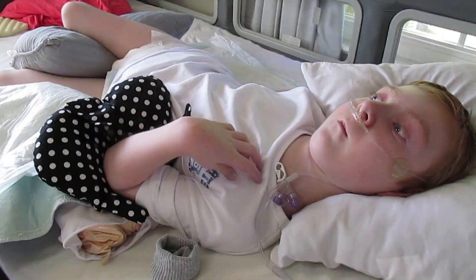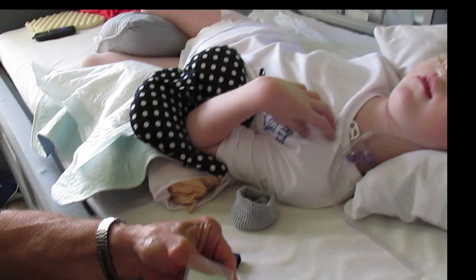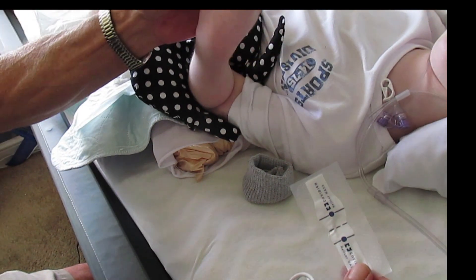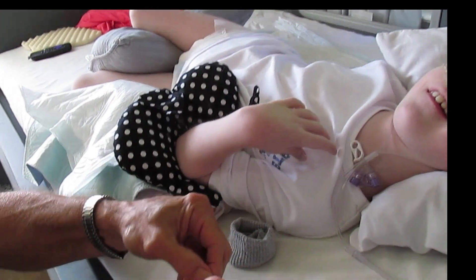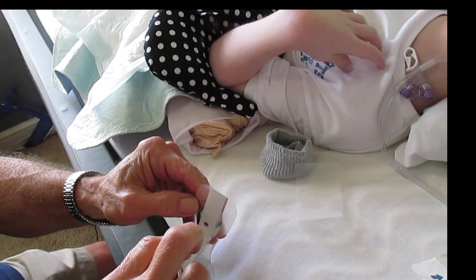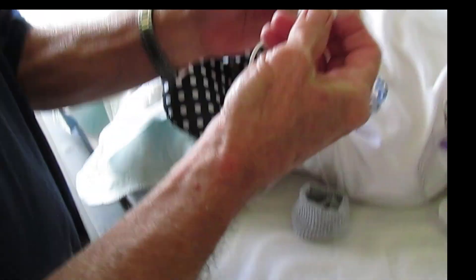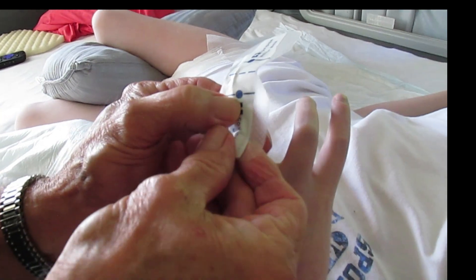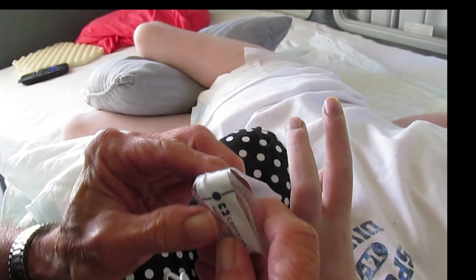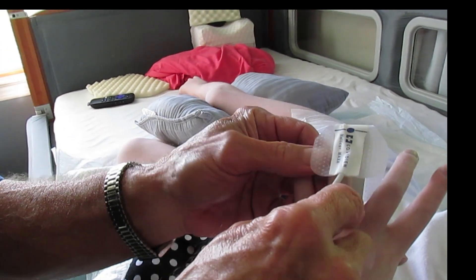First thing I like to do is put a fold in it before you start getting the tape out, because you want these two little dots to go through his fingernail — that's how it reads. We're going to be using the ring finger today. We peel it off the sticky backing — you can see the two little sensors right there. Before I start sticking it to him, I want to make sure it's positioned just right. You want these two little lines to line up, so I usually stick the bottom one first.